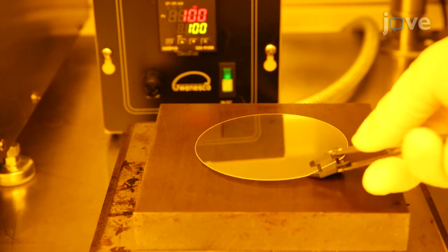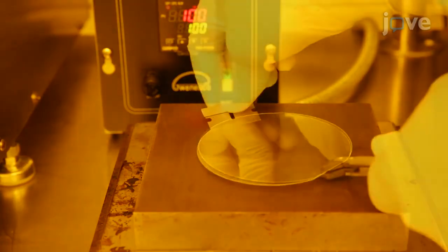To bake the wafer, place it on a hot plate at 100 degrees Celsius. After 3 minutes, transfer the wafer onto aluminum plate.